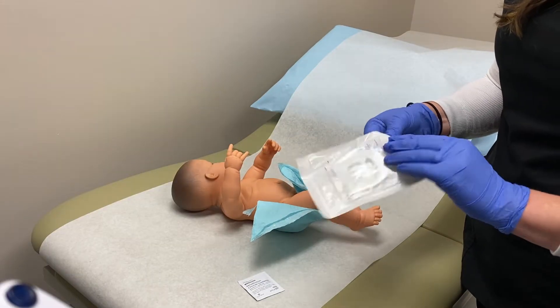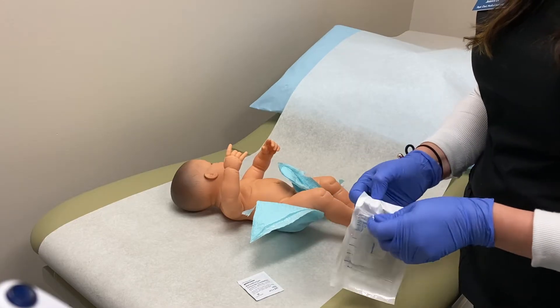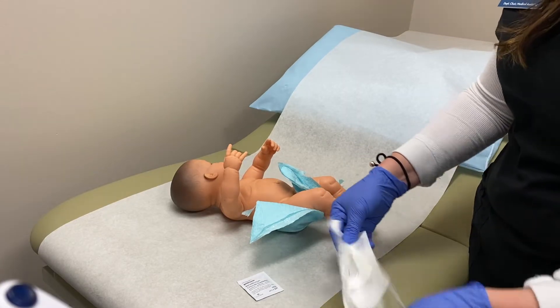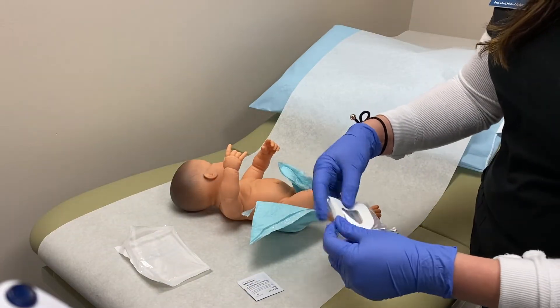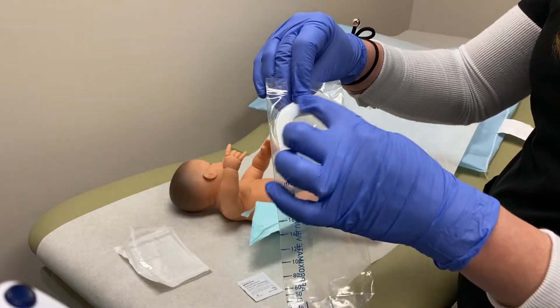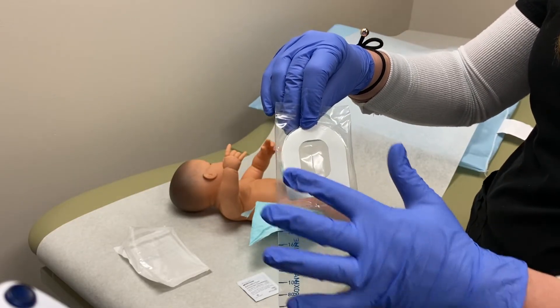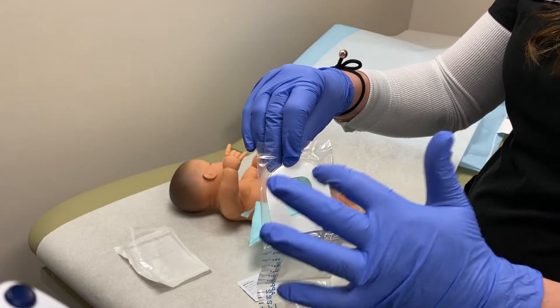So the first thing you're going to do is get your bag ready, because once you get going on this you want to do it pretty quickly. You don't want the baby to be without a diaper any longer than necessary. If you can see this urine bag, it has a U-shape — this is why we call them U-bags sometimes. It has a U-shape that goes over the baby's genitalia where their urethral opening is.